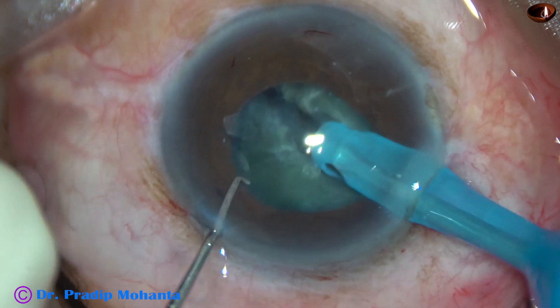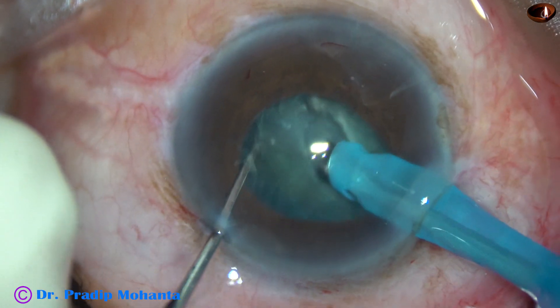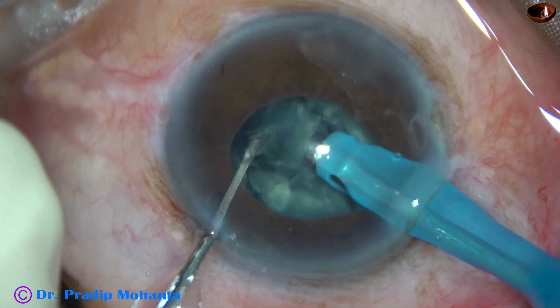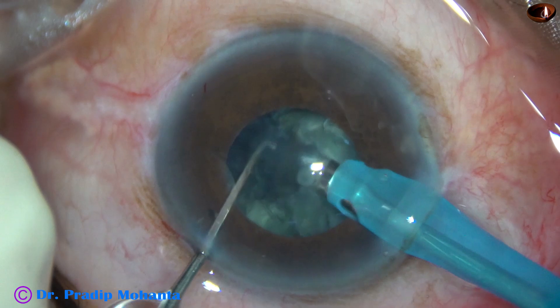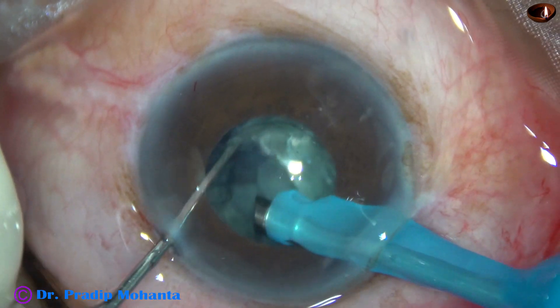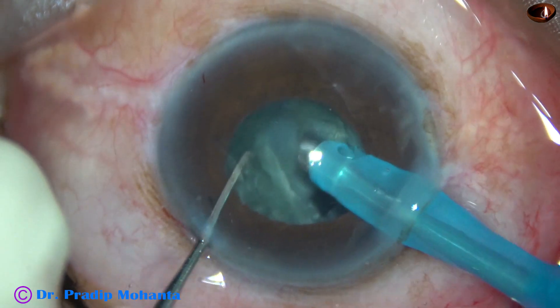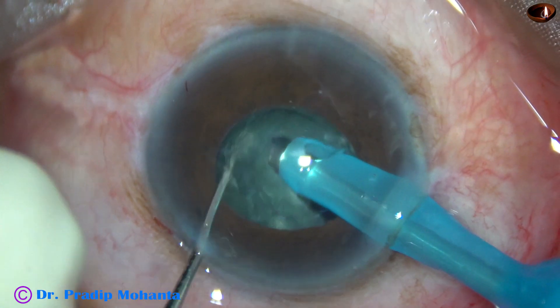And now, without rotating much, I hold it at this place and emulsify this free nuclear fragment to make some room in the capsular bag. And now I gently rotate the nuclear mass and hold it here and make another chop.